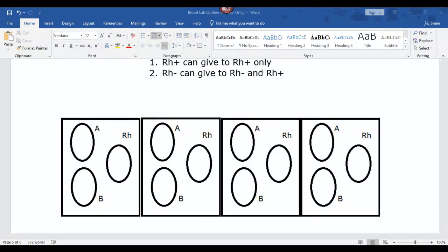Okay, I hope that video helped. It helps to actually see how the experiment is done. We've since modified our experiment in lab a little bit, but we use cards now instead of these wells. So I'm going to go through an example of each blood type. What you're looking for is clumping. If this well clumps, it tells you their blood type. You'll have to be able to identify that, and then you'll have to write whether or not, who can they donate to, who can they receive from.